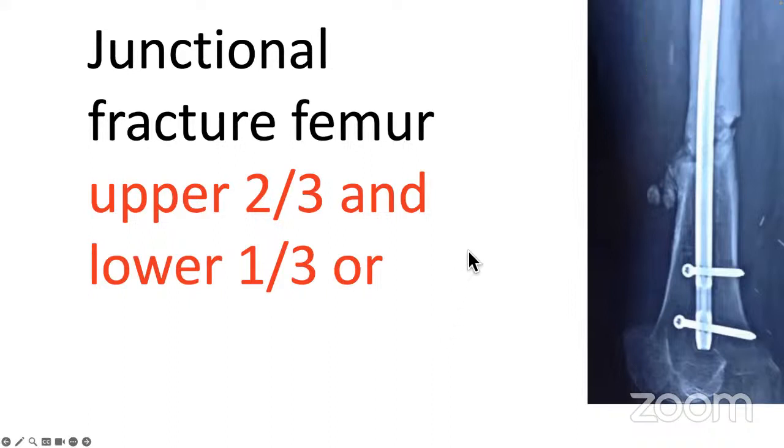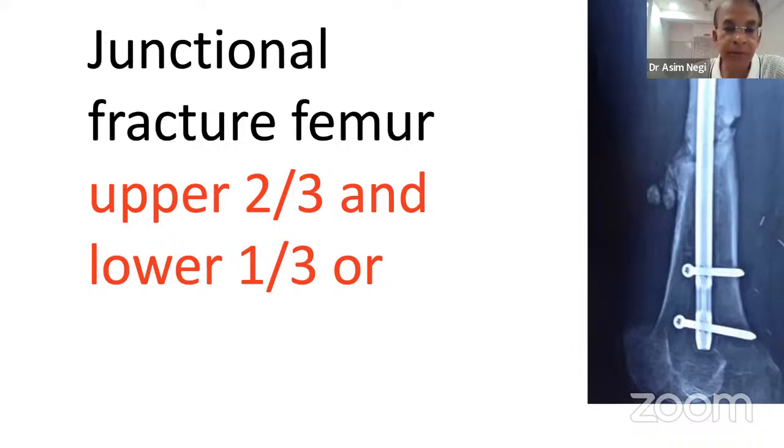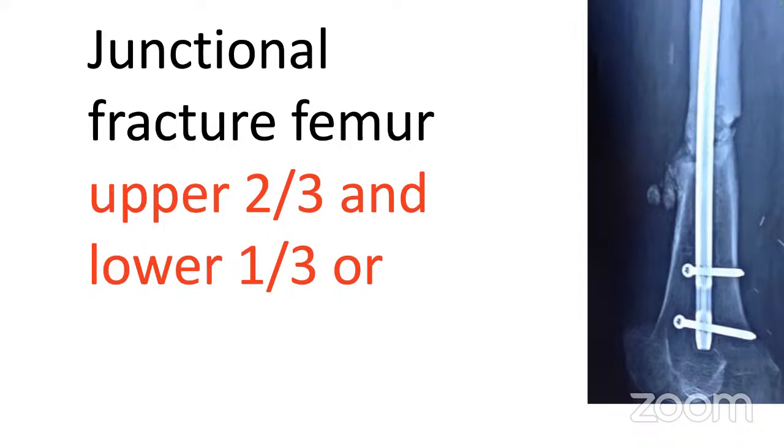How do you do it? So for tibia nailing, do you do it on figure of four? No, I use that attachment like the arthroscopy thing, which allows me to hang the tibia. The upper part of the thigh is supported and the leg is hanging down. I just start the entry and then somebody else is reaming and inserting the nail. I just sit on a stool and hold the reduction and maneuver things. So the guide wire, somebody else is passing.